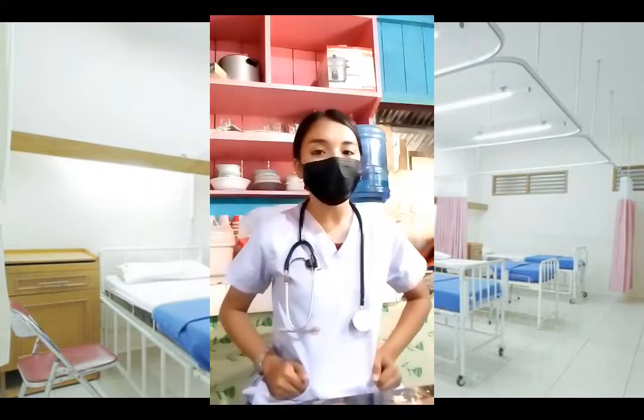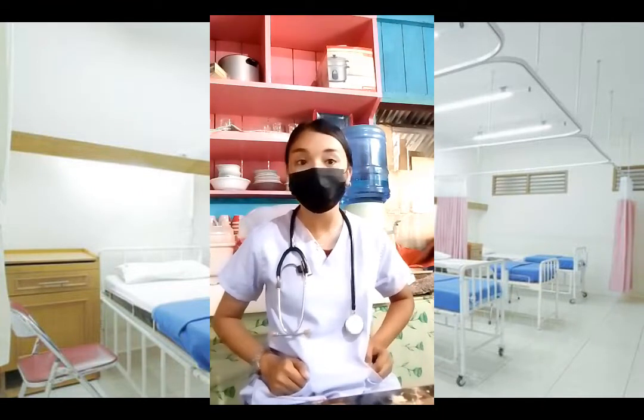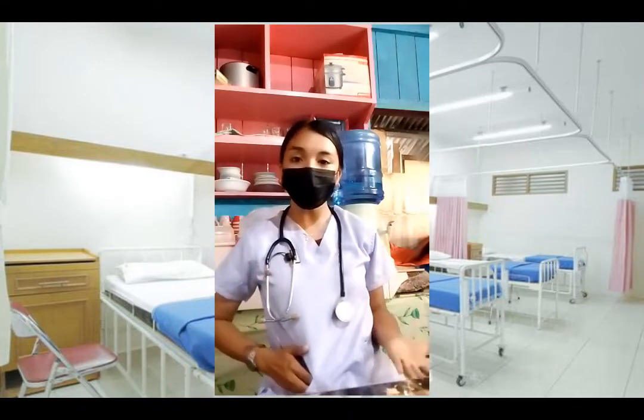The next procedure we need to perform is the urine specimen collection from an infant. Its definition: a pediatric urine specimen is collected from infants who are incapable of telling the time of urination and following directions for collection by themselves. Its purpose is to collect a pediatric specimen accurately. The materials and equipment are cleansing swab or cotton balls, towel, pediatric urine collector, and a diaper.